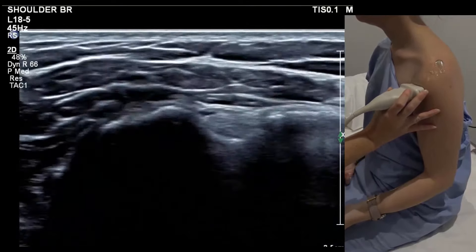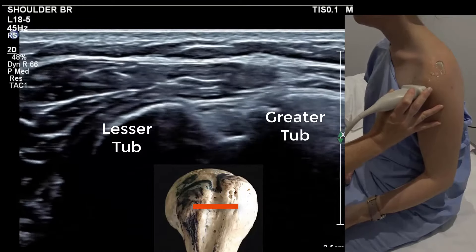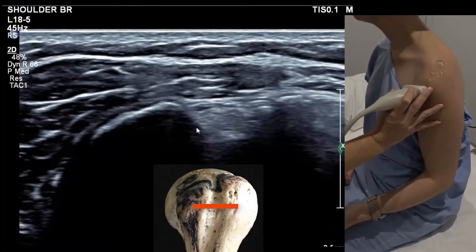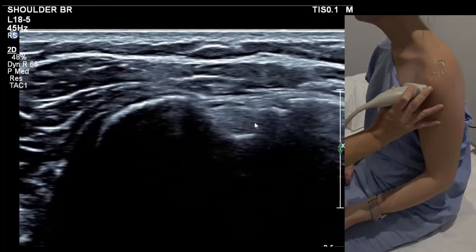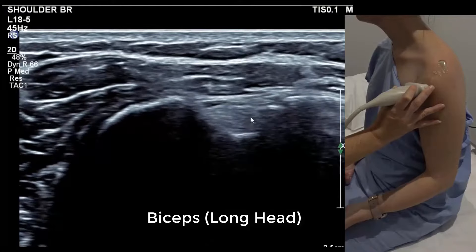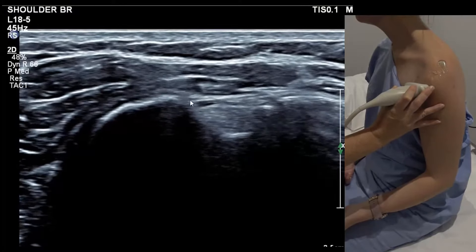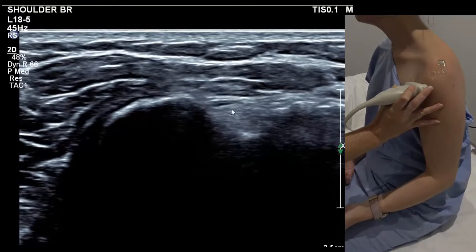Angle up slightly and run to the top of the groove. For a good picture, you have the lesser tuberosity and the greater tuberosity quite level, and make the tendon echogenic so it's not hypoechoic. We want to be able to measure around the periphery and check that there's not a bifid biceps — a double biceps or one that's partially subluxing out.